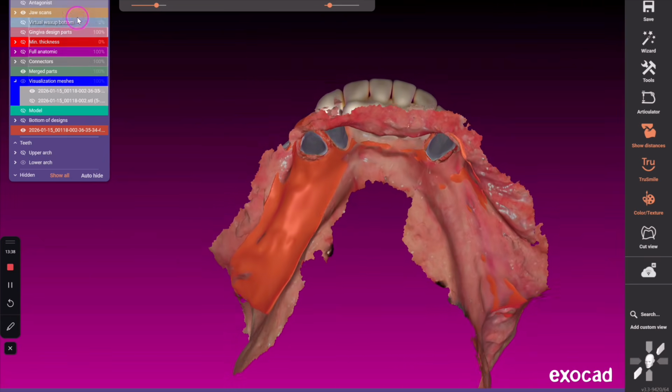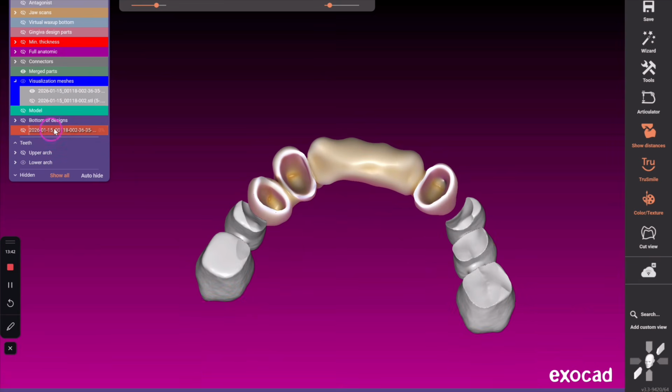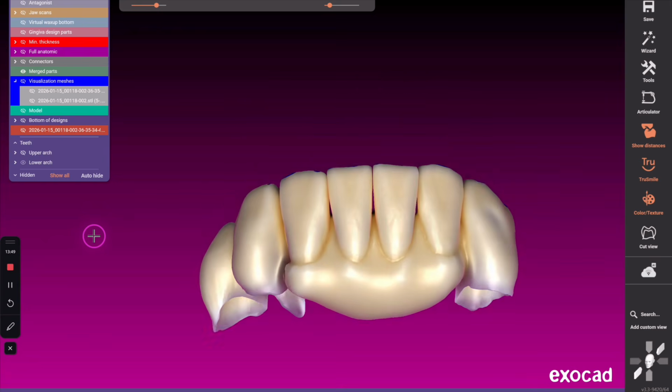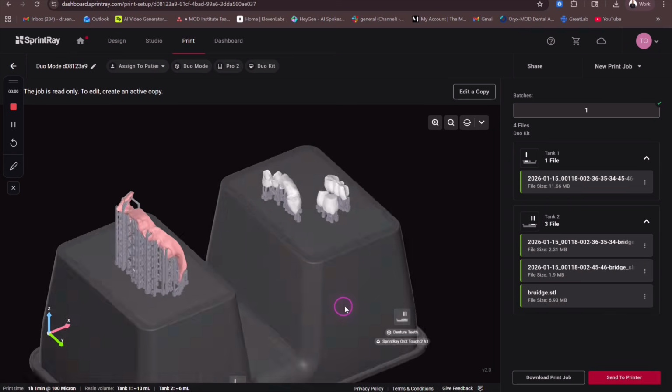And I'm going to paint that tissue. I'm going to print it monolithic out of Onyx Tough 2.0. And there's the underside surface of the bridge. And you can see it's perfectly convex. There's no concavities. It's extremely smooth and extremely easy for him to clean. Floss threaders could fit in those distal embrasures.